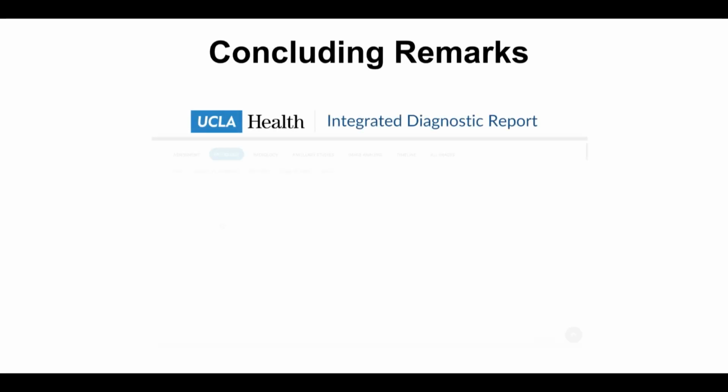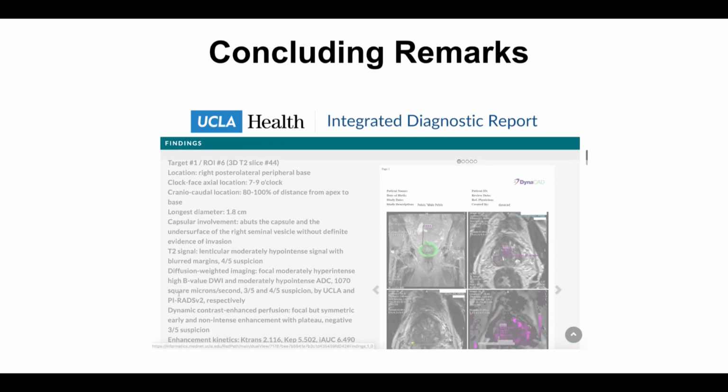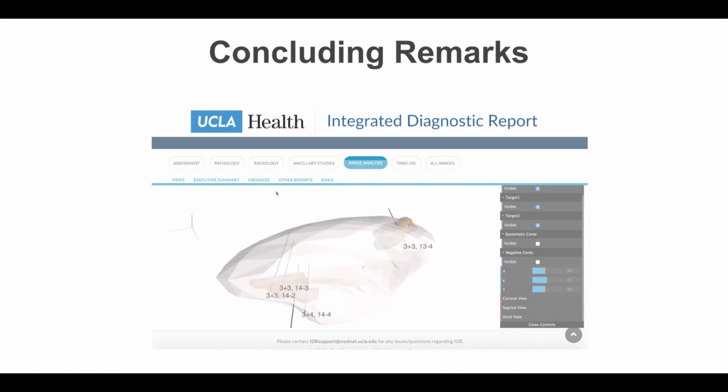This web-based, vendor-agnostic platform is based on our institution's source code, which can be made available cost-free to outside institutions on an individualized basis. We have personally found the URO-IDR to be a helpful and efficient tool in terms of procedure planning and simplicity of record keeping for both clinical and research purposes.